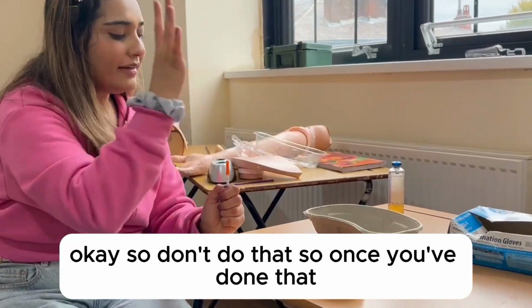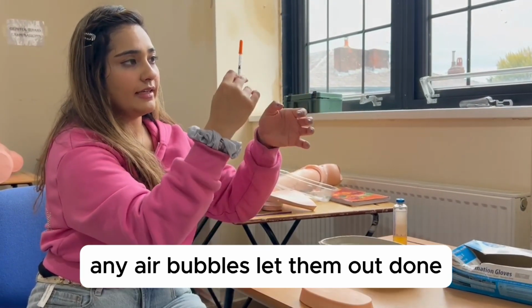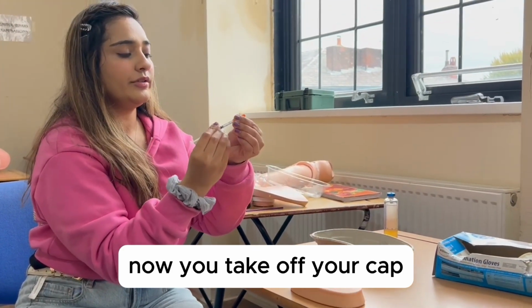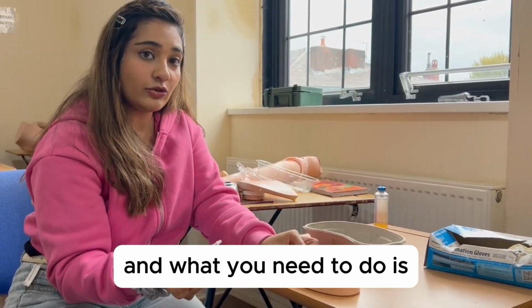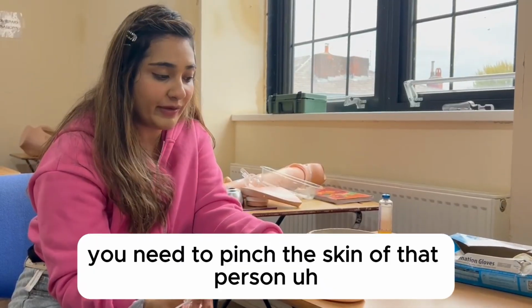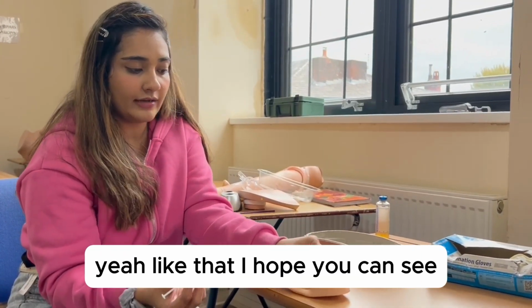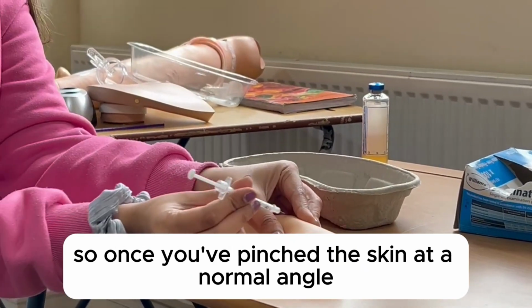Once you've done that, quickly tap your medicine, any air bubbles, let them out. Done. Now you take off your cap, throw it in the dustbin. And what you need to do is the pinch method. You need to pinch the skin of that person. Pinching means you have to, like that. I hope you can see. So once you've pinched the skin at a normal angle, very easy.